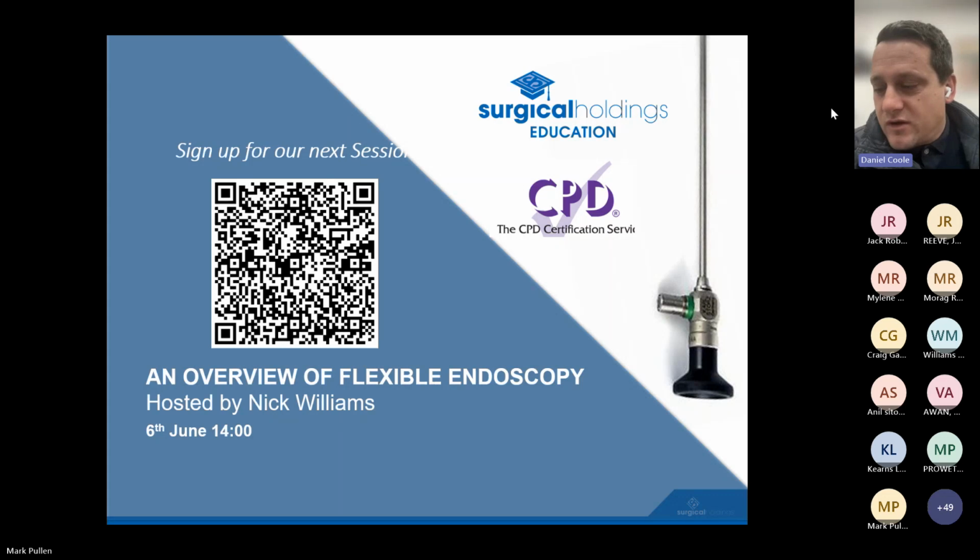One thing, I've written down a couple of comments, most of which you covered, Mark, actually, but one was just really around the importance of the light cables, and just reiterating that, really, because quite often that gets overlooked. And I've particularly seen where bigger cables have been put on smaller diameter scopes, and that has caused problems. And I think maybe it's not necessarily realised how much the extra power flowing through the light cable and the damage that can do to the scope itself. That can result in a major repair. So that is something to be aware of.